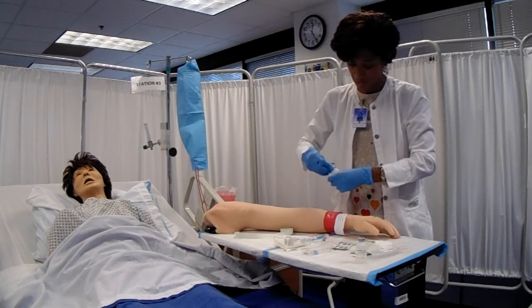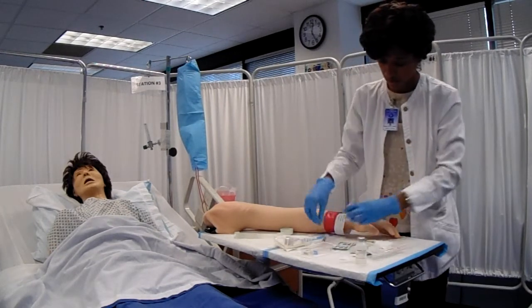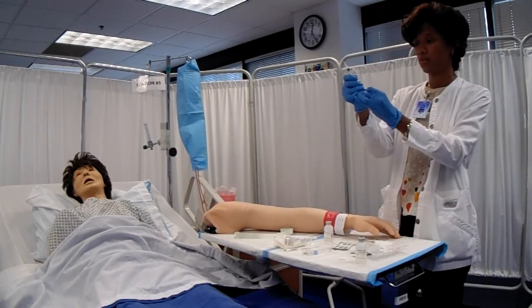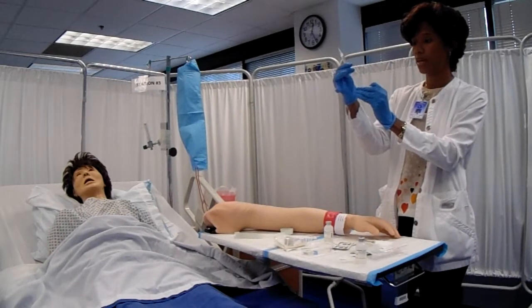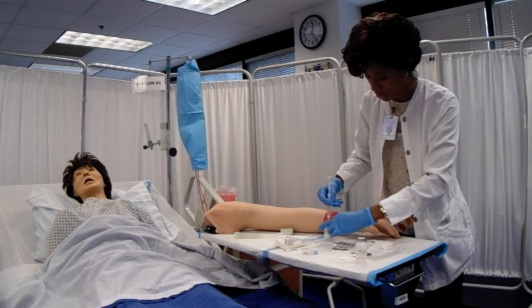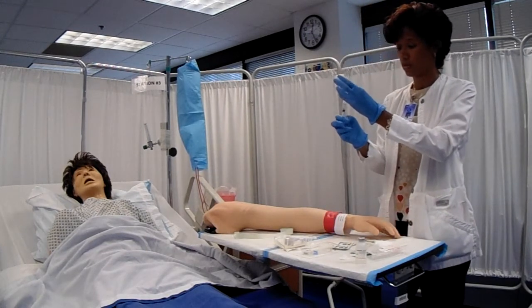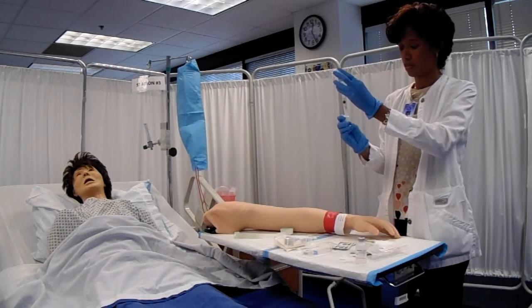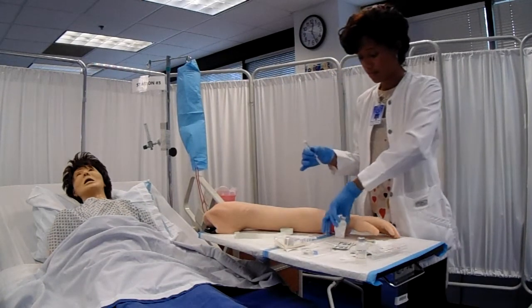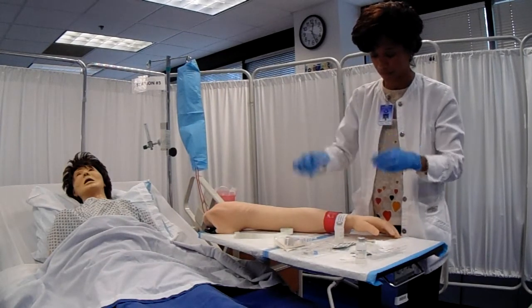I'm going to scrub the top of my vial, and I'm going to go ahead and displace 3 mLs of air so that I may pull up 3 mLs of saline. It's a blunt, clean needle, so I can recap.